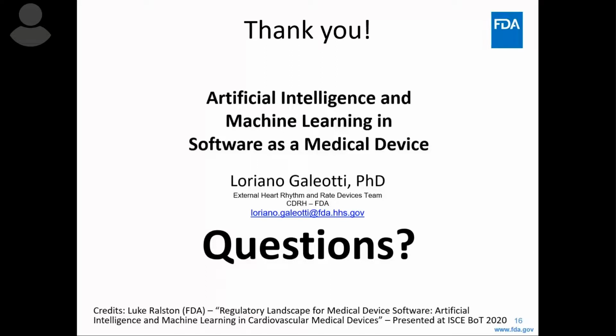Sure, that makes sense. So it's okay for the training, but not the testing. Yeah, for training, yes. For what we are concerned with, in the end, we look at the device as a black box. You did something, you get something that seems to work. Feed some data and see how it works. I talked before about a continuum between purely rule-based and full artificial intelligence or machine learning devices.